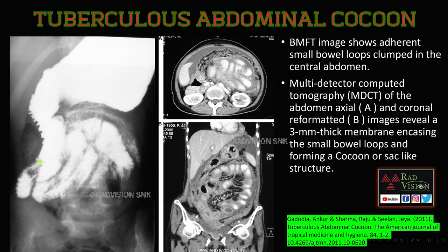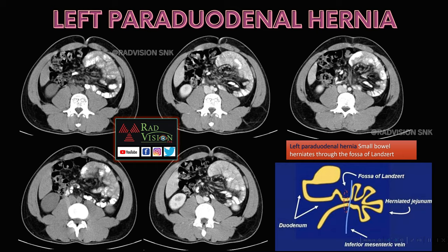On MDCT axial and coronal post-contrast images, there are multiple small bowel loops clustered and surrounded by a 3 mm thick enhancing membrane, with ascites. This was a case of tuberculous abdominal cocoon. Cocoon can also be seen in tubercular abdomen, especially the wet type of tuberculosis.